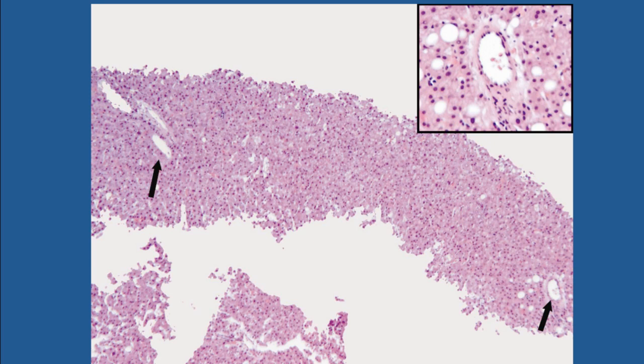But what happens if we do not have fibrous tissue and the normality or otherwise of the liver architecture cannot be determined? Well, in that case, it is very important to look for the presence of central veins and portal tracts occurring at a regular interval. So here we have a biopsy which is all pink.